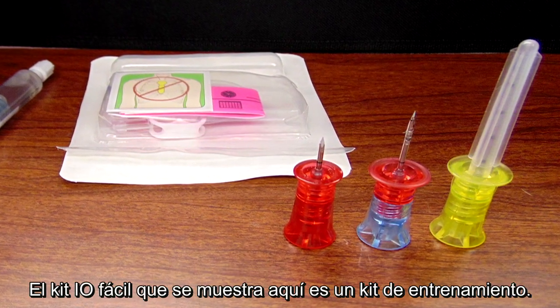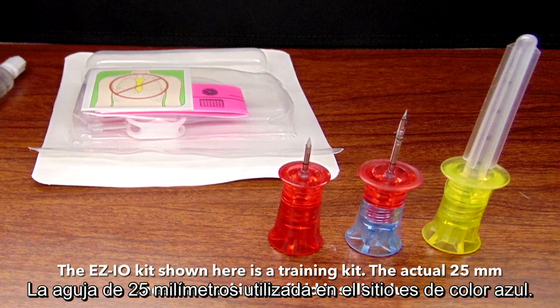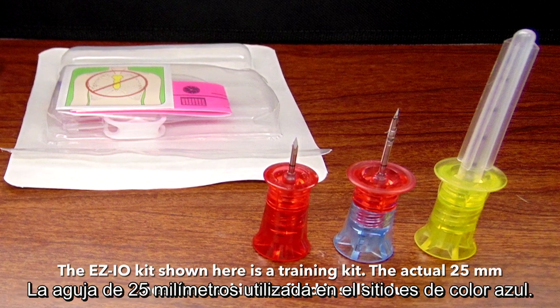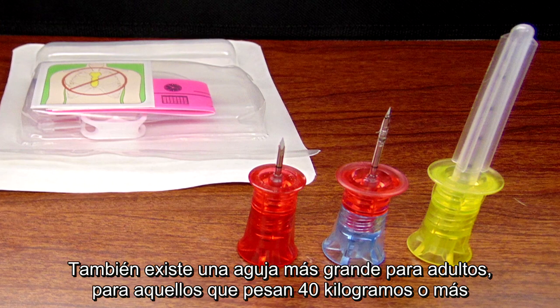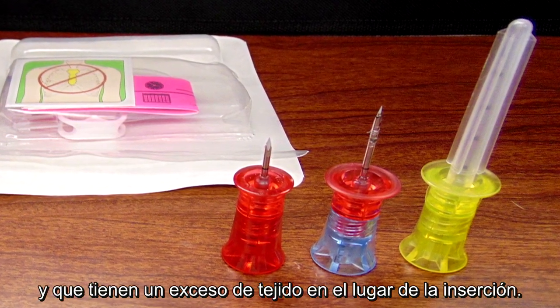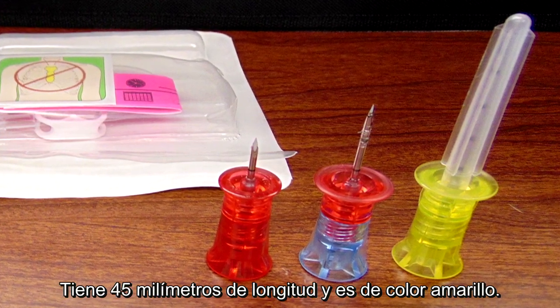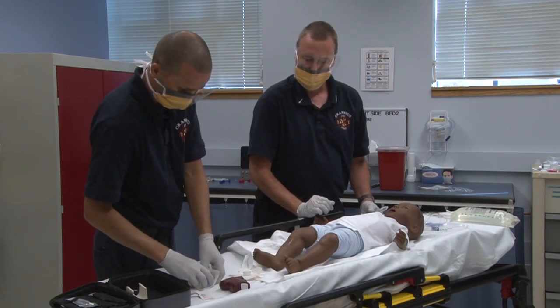The Easy IO kit shown here is a training kit. The actual 25 mm needle used in the field is solid blue. There is also a larger adult needle for those greater than or equal to 40 kilograms with excessive tissue at the insertion site, which is 45 millimeters in length and yellow. Attach the needle to the Easy IO drill.